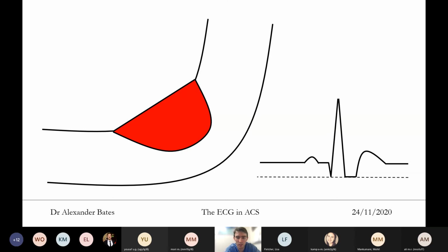This is quite technical to explain, but essentially the reason for it is that the infarct is another site, and when you put an electrode over it, that actually raises what you believe to be the isoelectric line up, rather than actually having something lowered down.